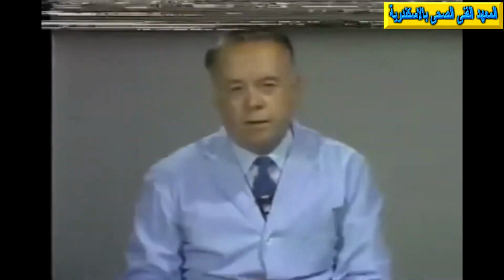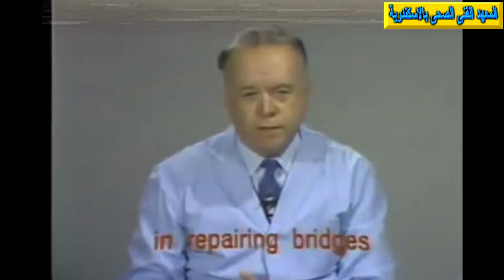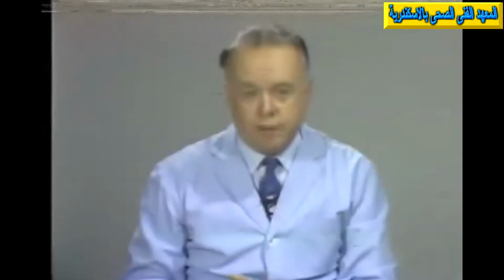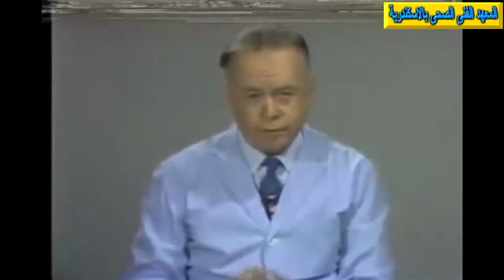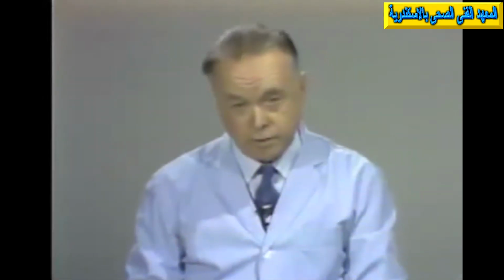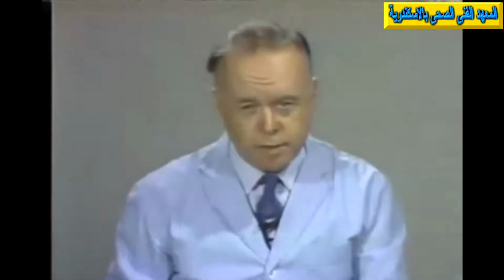And then again, the fourth use is in repairing bridges. Extensive bridges which may develop problems can often be repaired by cutting off a section of the bridge, cutting a semi-rigid connector into the remaining part and replacing just a part of the damaged bridge. So those are the 4 uses which we'll look at in greater detail.